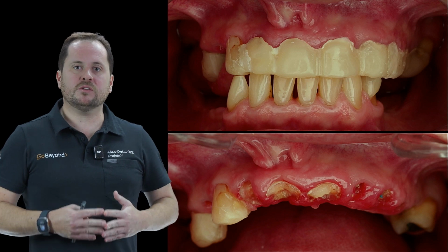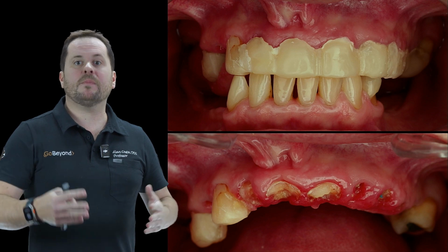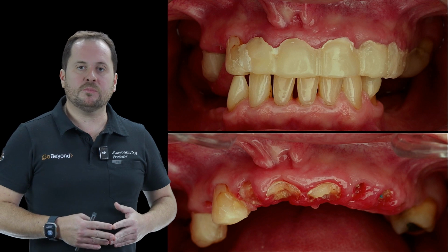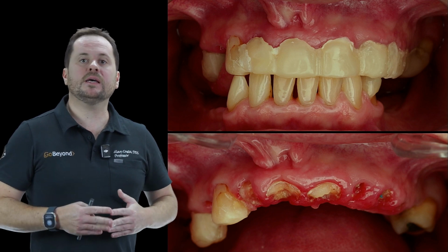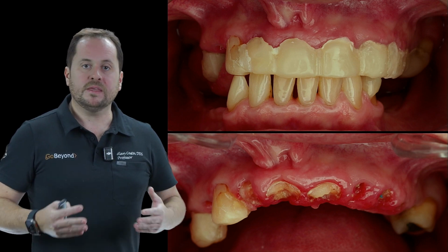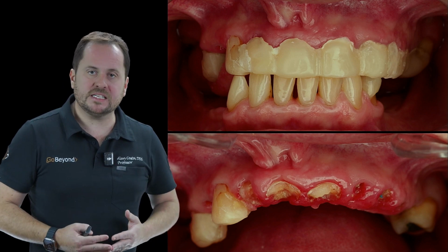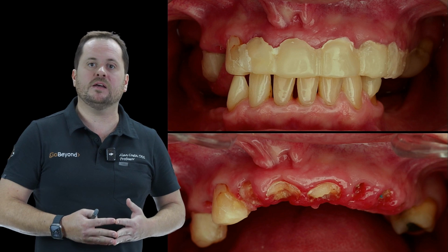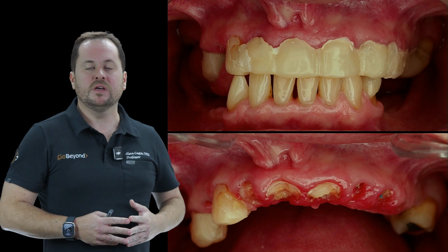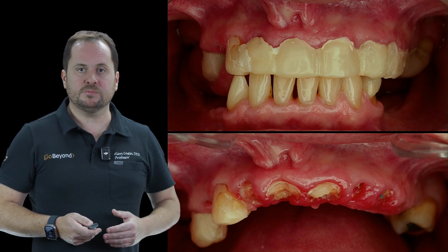But have you ever thought that today you can work with printed provisionals, which are incredibly versatile and customizable? Here, I will show you in detail how we used BioCrown resin from MakerTech for the development of this case, its evolution over time and under various conditions, and its adaptation. This provides you with a super aesthetic alternative, one that offers both resistance and aesthetics, as well as material economy, ensuring durability and a high quality finish, making it an excellent choice for a wide range of applications. And using materials like this reduces costs in treating the patient.